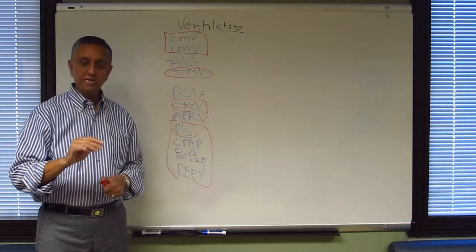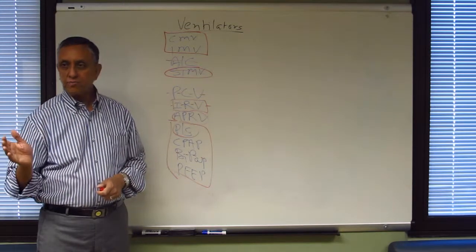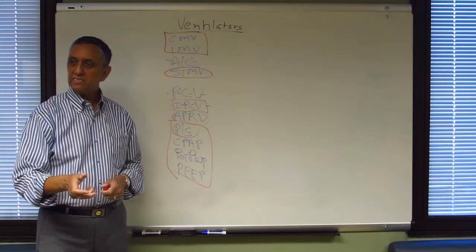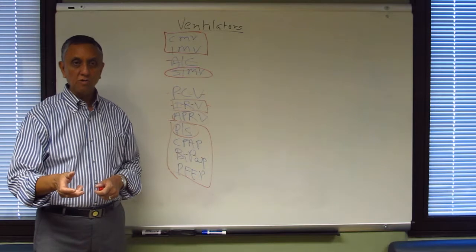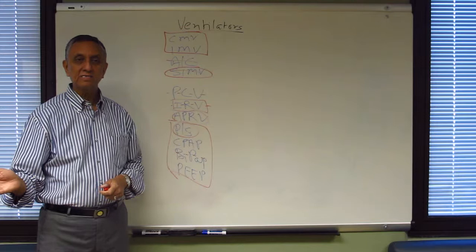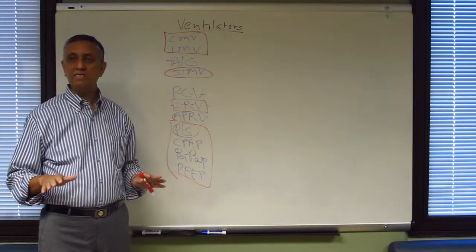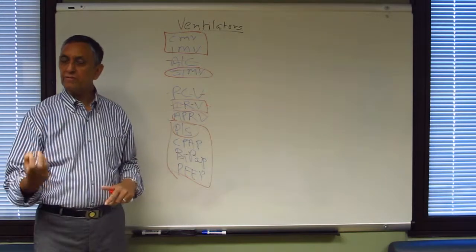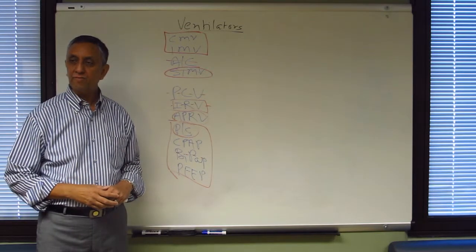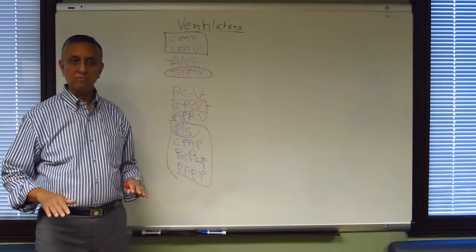Okay? So, you have a patient on SIMV mode and the patient is over-breathing the vent, those breaths, the machine will give pressure support. If you change that to assist control mode, you'll notice all of a sudden the pressure support will disappear from the screen, because there is no pressure support when patients are being ventilated with assist control mode. Because every breath that the patient initiates, the machine is going to give full. So there is no pressure support with assist control mode.